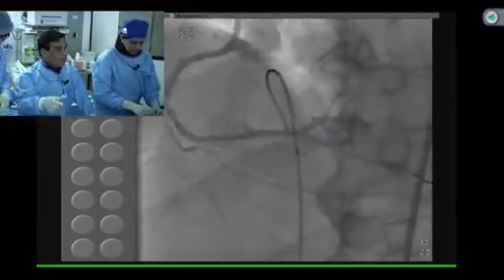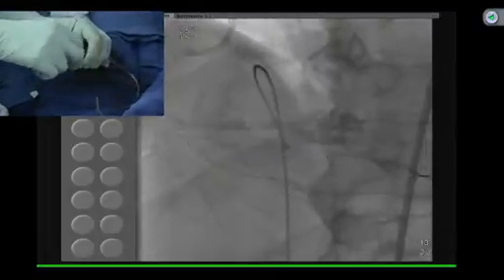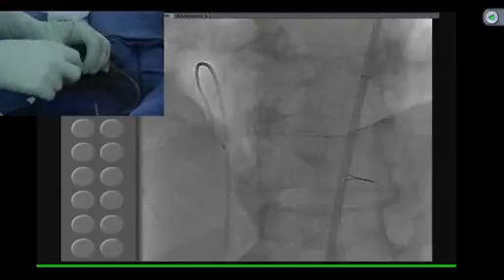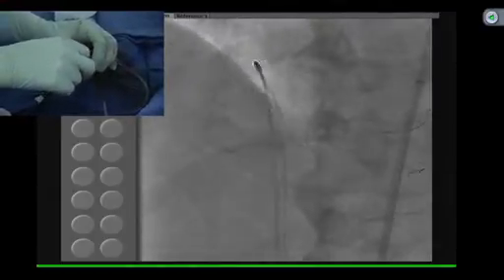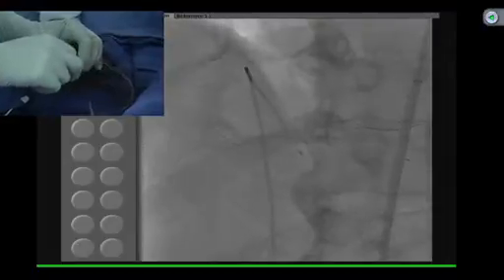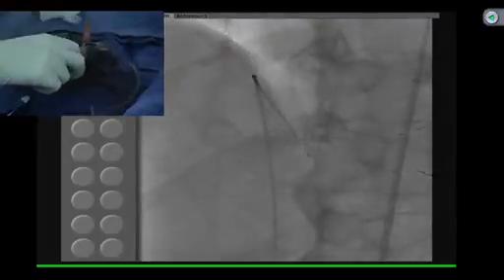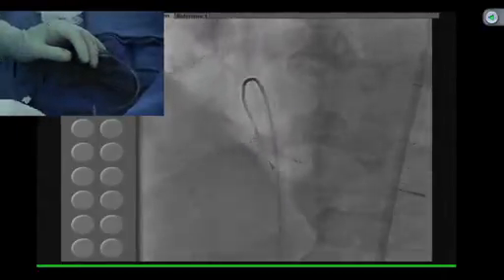Samin, to me, one of the understandings of this case is the maturity to decide, after all, how many distal lesions do you chase, how many small branches do you fix, and therein I think lies the wisdom to do exactly what may be appropriate here. This is what stent do you have there? This is the 2.75/28 XIENCE. Okay.